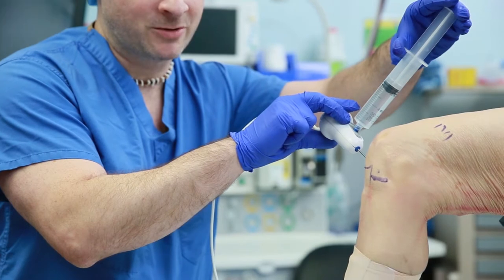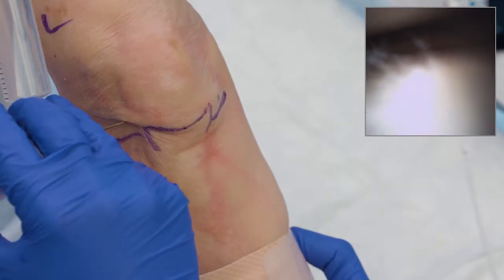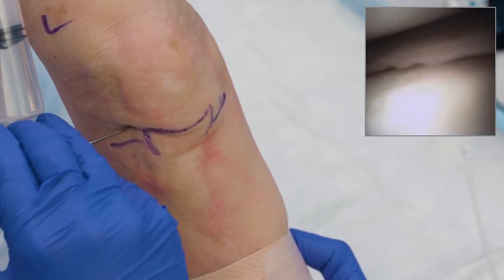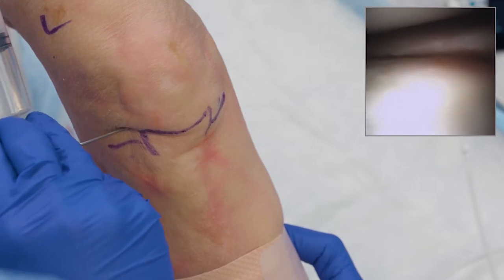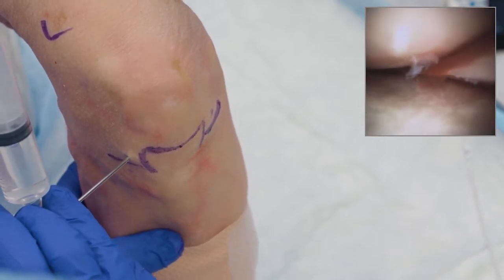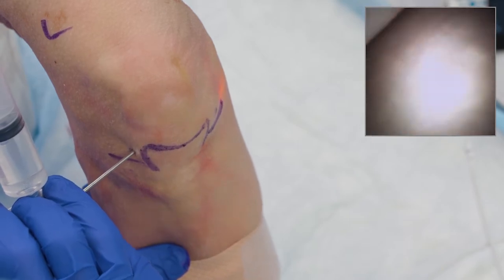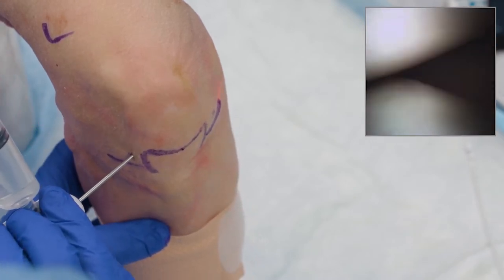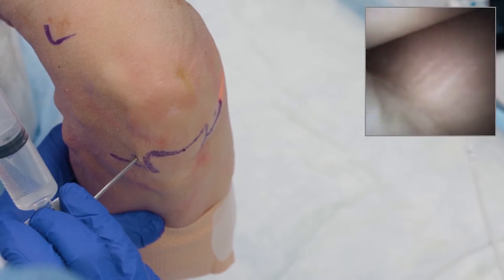To get around to the posterior horn of the medial meniscus, extend the leg to help sweep underneath — you can do this yourself or with an assistant. If you get some cartilage or synovium in your view, give a gentle flush, which will make the meniscus flutter so you can see it and move any degenerative cartilage out of your field. As you back out, evaluate the leg from extension down to flexion, look at the cartilage, and identify any chondral defects. Then sneak just above the meniscus into the medial gutter and flex-extend the leg to check for loose bodies, as they like to hide in those recesses. Hyperextension or hyperflexion will help reveal them.